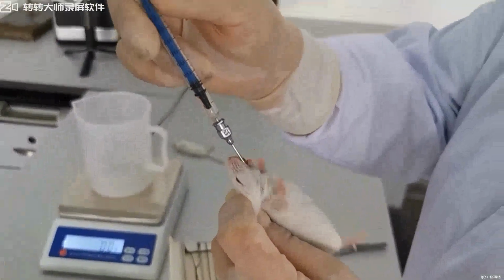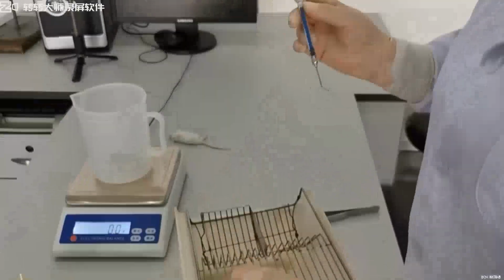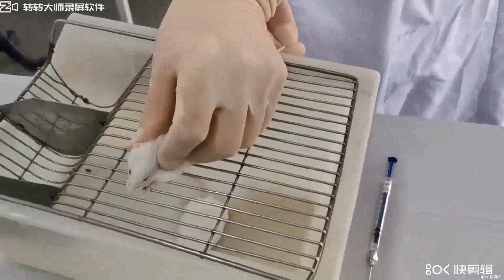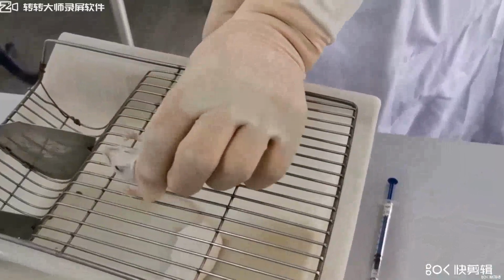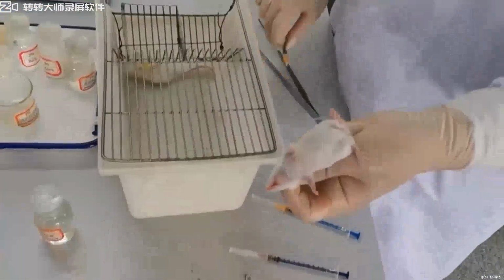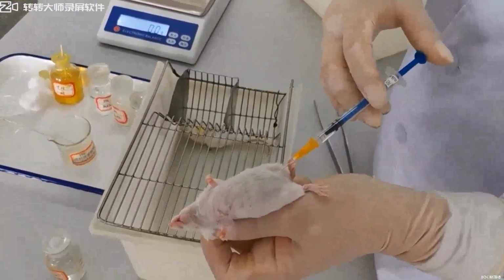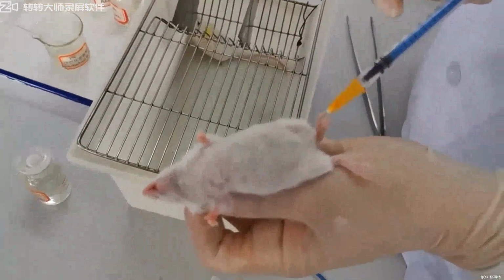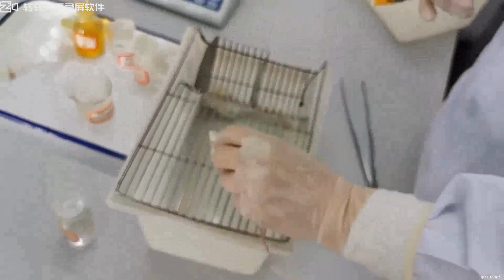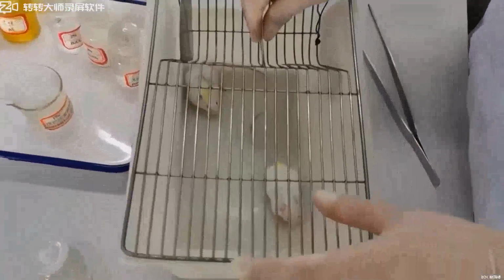Now, you can guess what the differences among these mice. They administered these drugs at the same dose by different routes. This one administered peritoneally, at the lower abdominal part, and put them in the cage. Observe their activities.